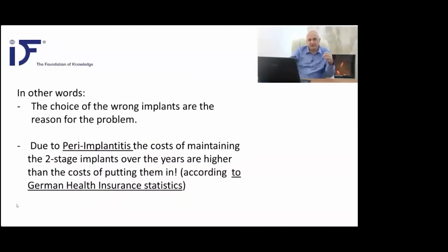So in other words, the choice of the wrong implants is the main reason why we see peri-implantitis. So if every doctor would use polished implants with a thin, small shaft diameter, and single piece design implants, peri-implantitis would not appear. This has been shown in a number of scientific investigations, so this is all known to the public. This has been published in high-ranking PubMed journals. Nevertheless, our profession doesn't want to accept it, so they continue like they did before.